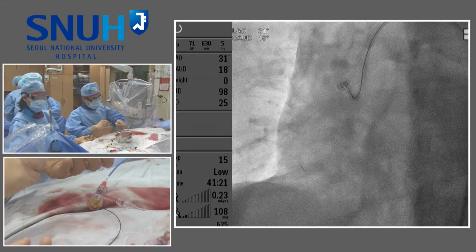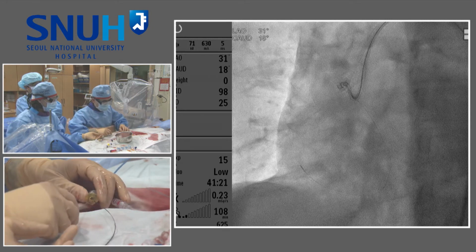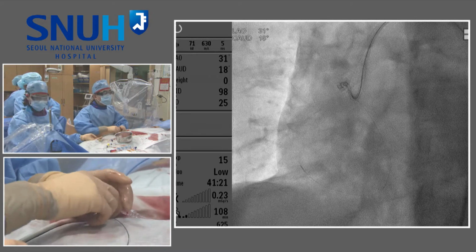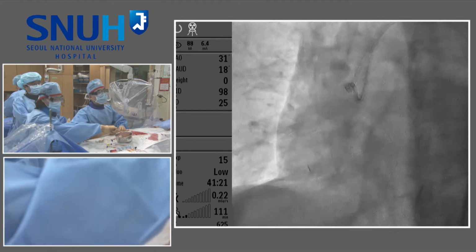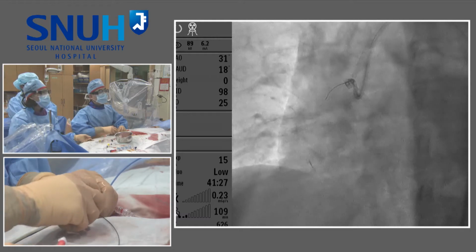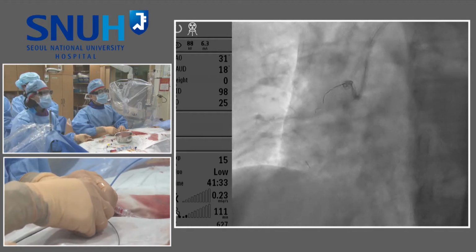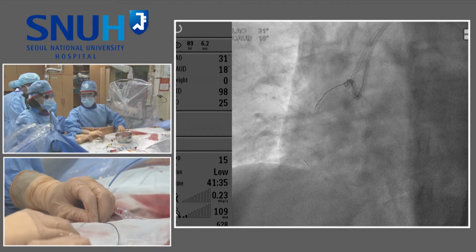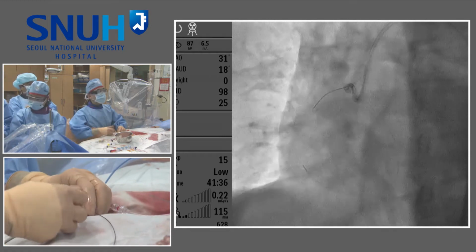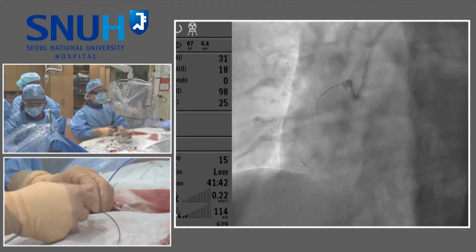So this would have been a good case for even ADR with Stingray. And you already have the antegrade wire almost all the way up to the mid portion, which is really nice. But the problem is poor backup. We cannot proceed across. Okay, this is a microcatheter. Did we not mount the microcatheter? You mounted it. The wire cannot pass, cannot advance.